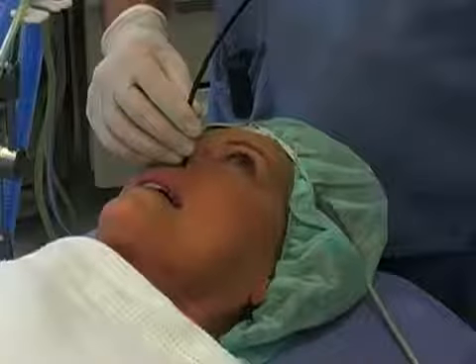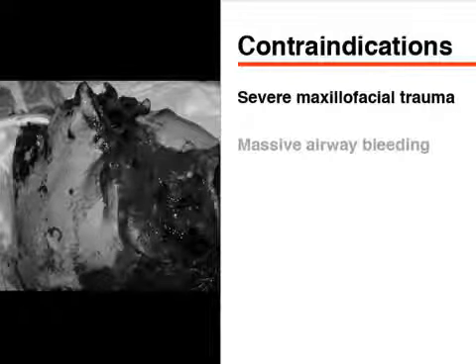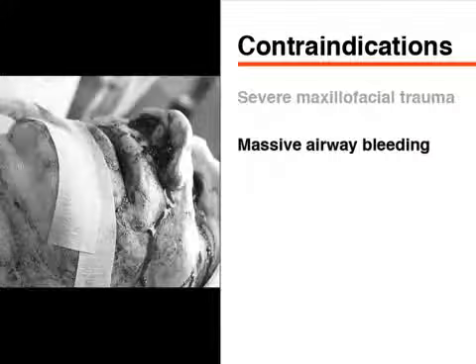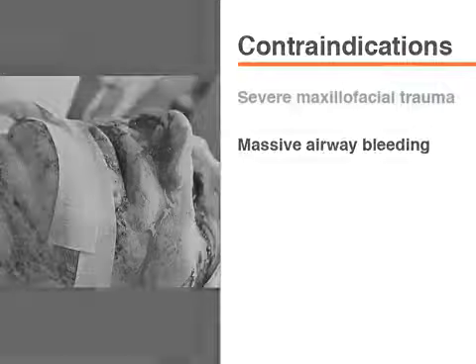Nasal fiber optic intubation should be avoided in patients with severe maxillofacial trauma, since the fiberscope or the tube may inadvertently enter the brain. Massive airway bleeding is a relative contraindication to fiber optic intubation and should only be used by experienced anesthesiologists.